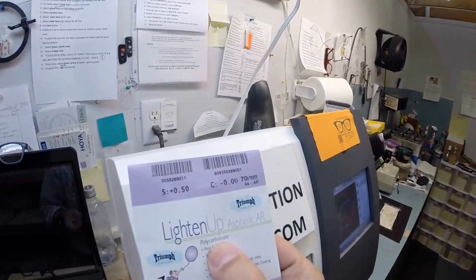Now if you see light flickering in the background, that is water running to catch the optical sawdust. As you can see it now as it begins to come off of your lens. The polycarbonate lenses cut dry, where plastic and high index plastic and Trivex cut wet. Water will kick in for the last 20 seconds of the cutting cycle just to wash away any optical debris, but polycarbonate cuts dry. As I mentioned, your lenses are made out of polycarbonate.